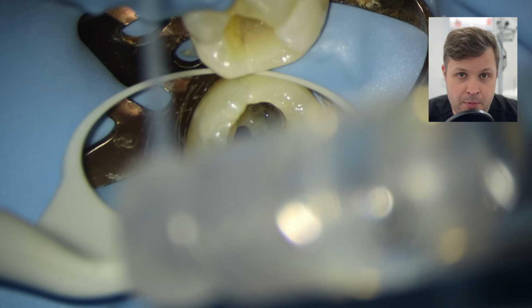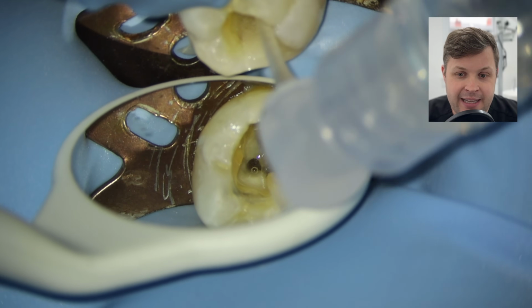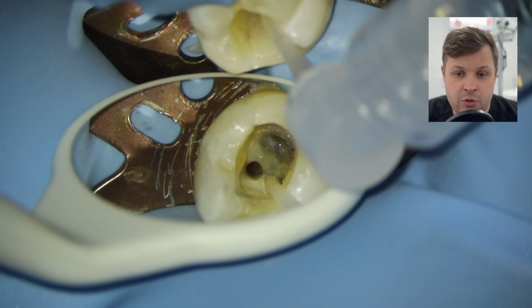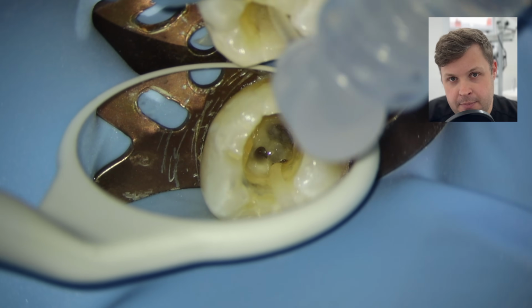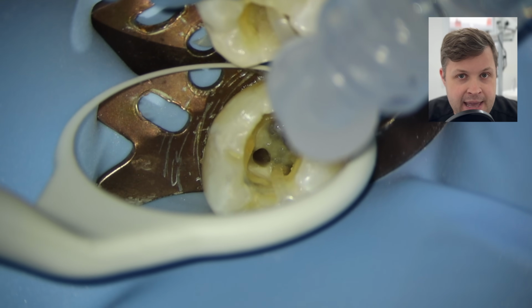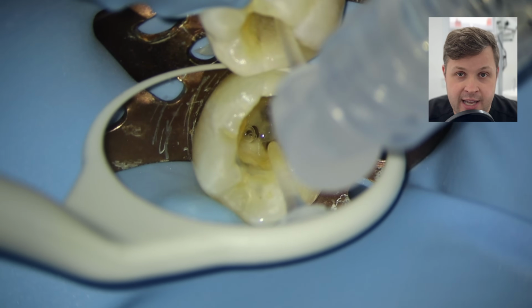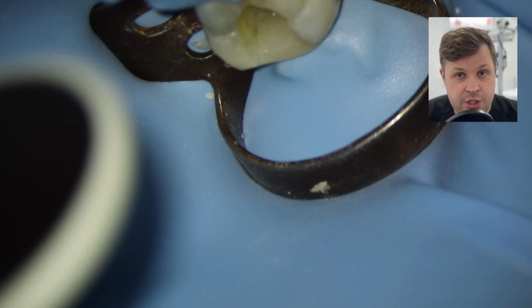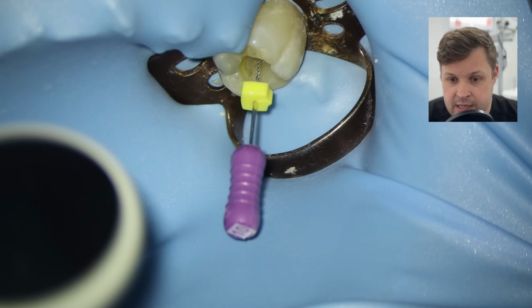And as we aspirate and irrigate the mesiobuccal canal, you'll notice here that the mesiolingual looks like it's confluent, because when we irrigate and aspirate the mesiobuccal, the mesiolingual also irrigates and aspirates at the same time. So remember what we were saying before about the difficulty down the mesiolingual, does it join? So this is making me feel that the two join. Now, of course, it might just be because they're joined with lateral canals, so it's just an indication for now, but it's something in the back of my mind. We're going to think about possible confluence here.